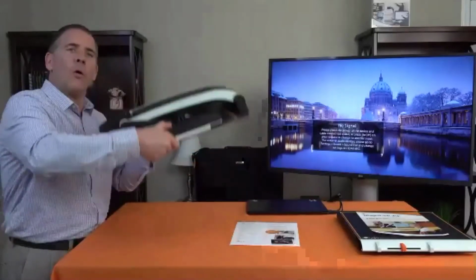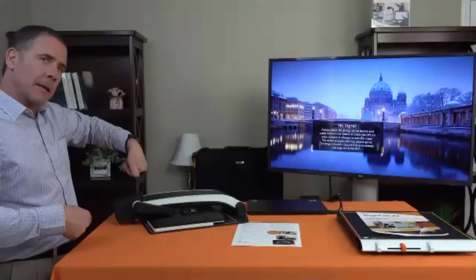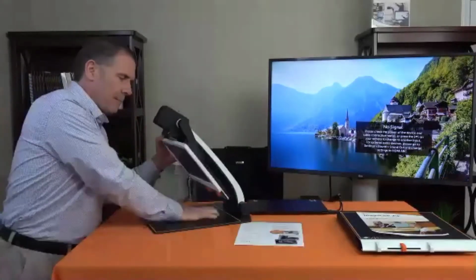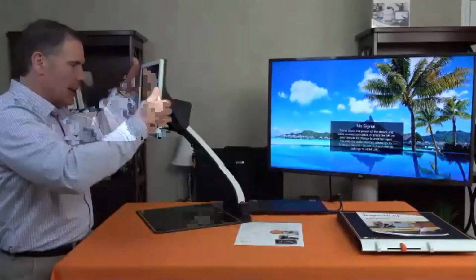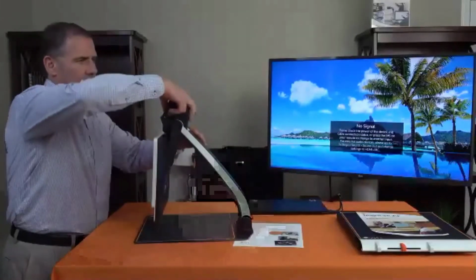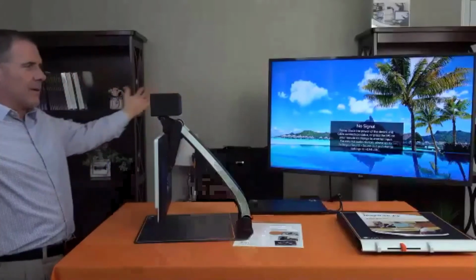Now, when I want to open my zip, I put it down, I put my thumb on the plate, and then I pull on here, and it makes a click noise. It's locking into the first joint. Then I pull around here, and I don't know if you heard that, but it makes a click noise. That's making sure the camera's in the perfect down position. I'll let you see the camera a little better now. Here, see, it pops up, and it rotates this way, all the way for self view.